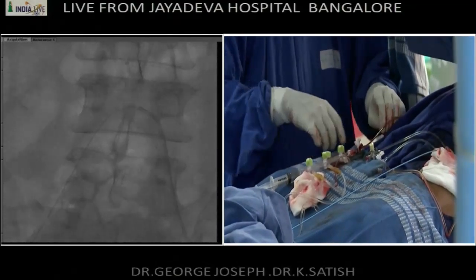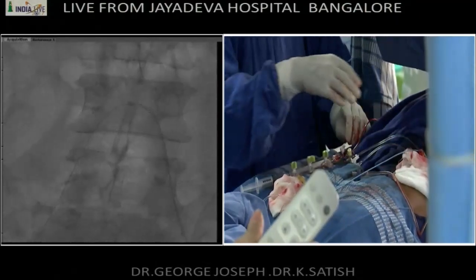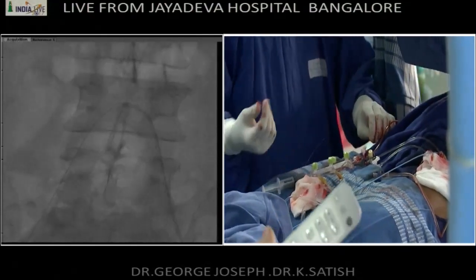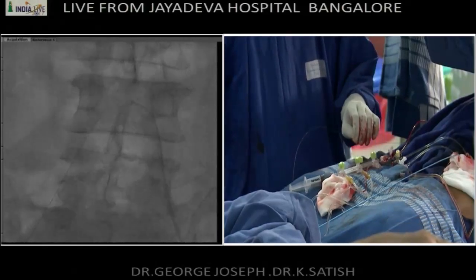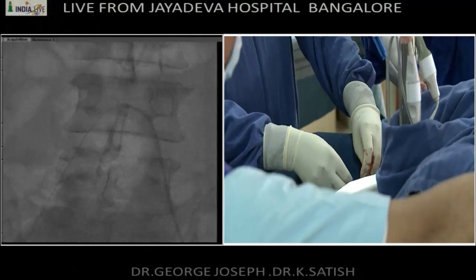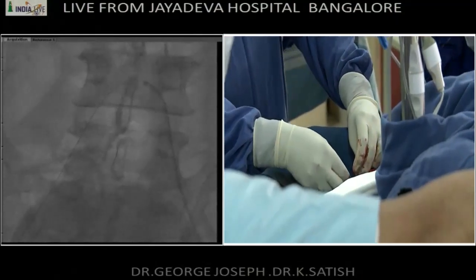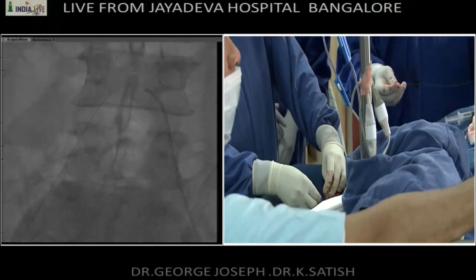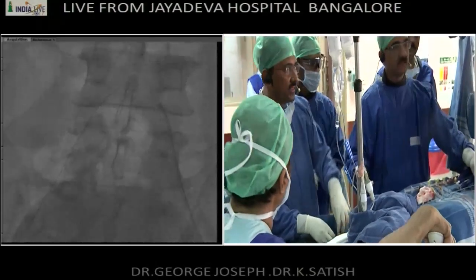It's important to do this through a catheter, otherwise the wire can actually slice through the aortic bifurcation. And you shouldn't exert too much force while doing this. So he's pushing the wire and I'm gently pulling the wire. So once I've got enough length on this side to insert a 100 centimeter catheter, I'll go retrograde with another catheter.